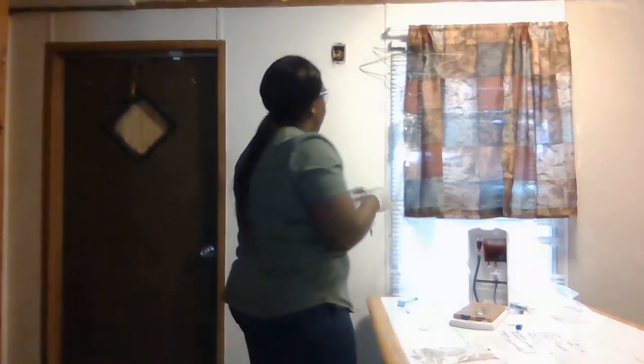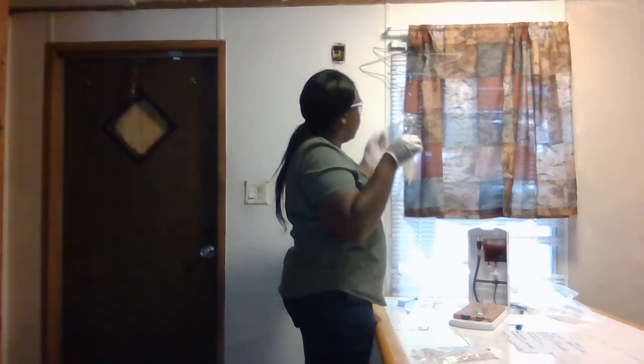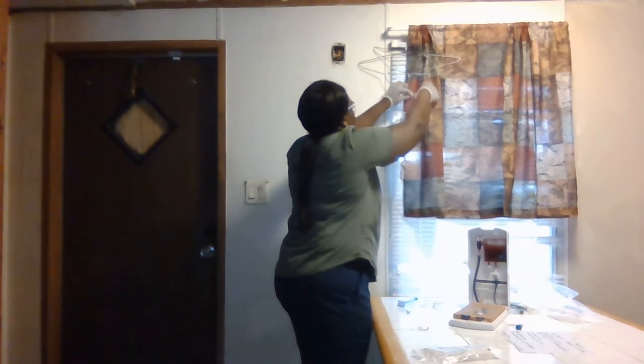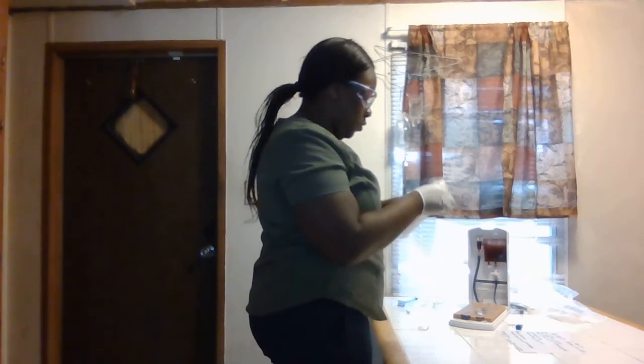Alright, so I'm going to hang my bag, and my secondary bag is always higher than the primary bag. Secondary set, again, I check my expiration date. It's not expired, there's no cuts, holes, tears, or wetness or damage done to the package.